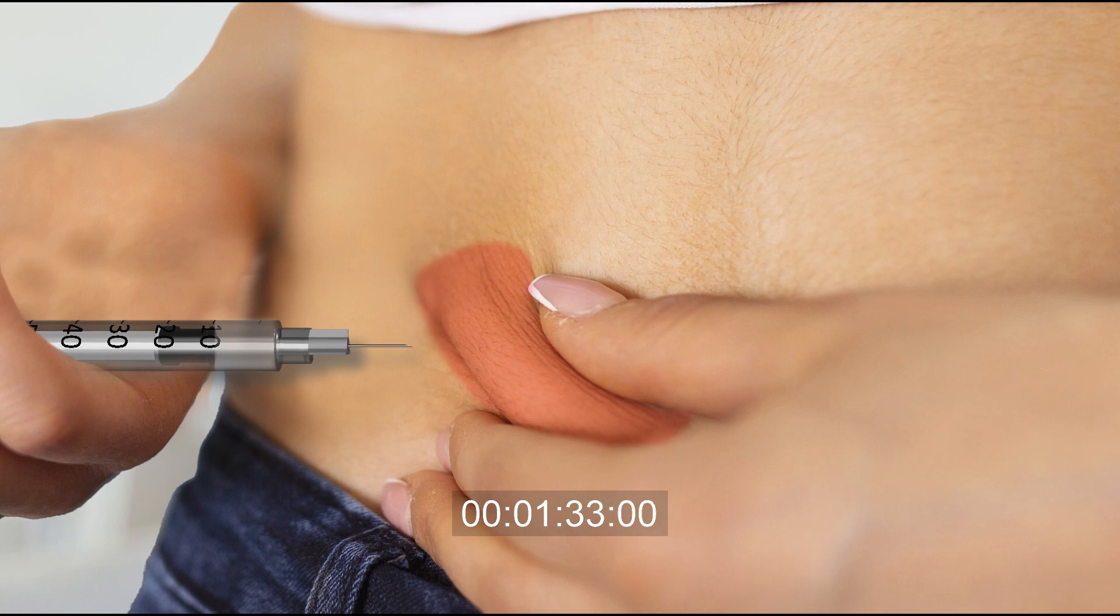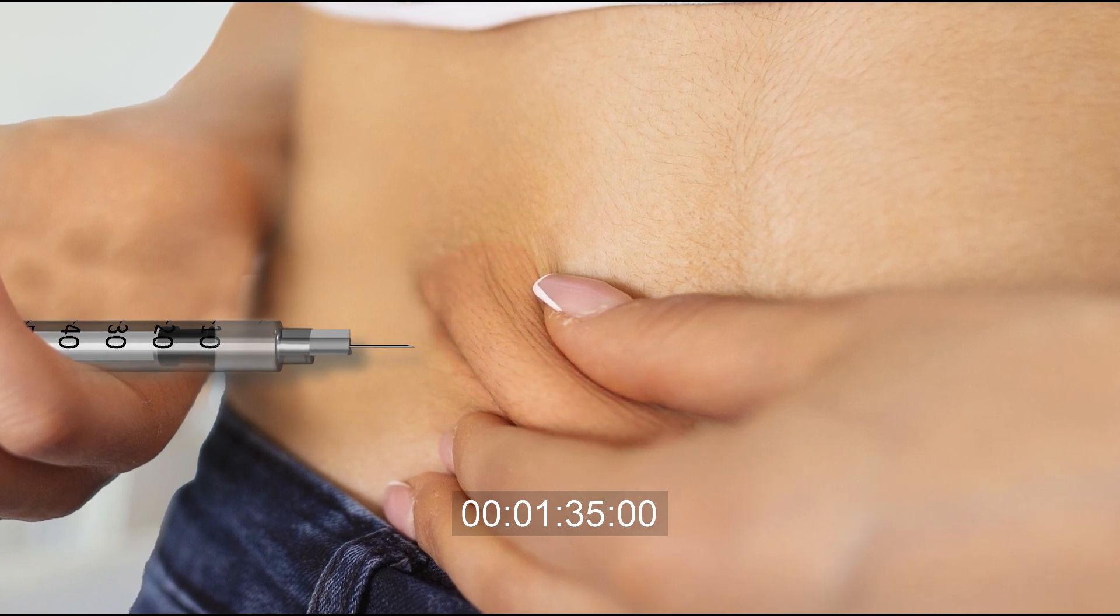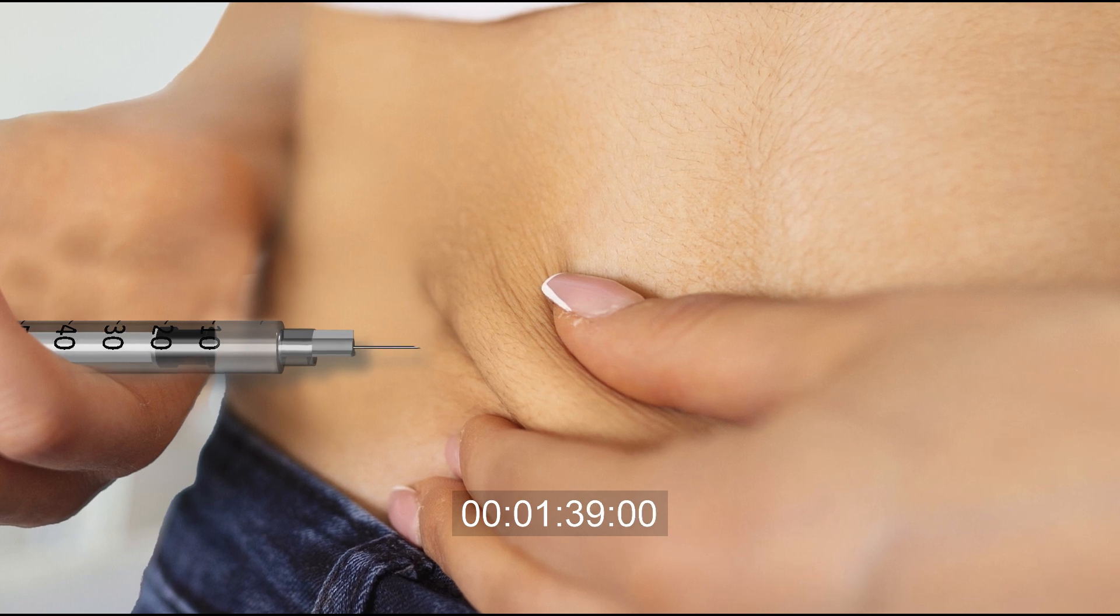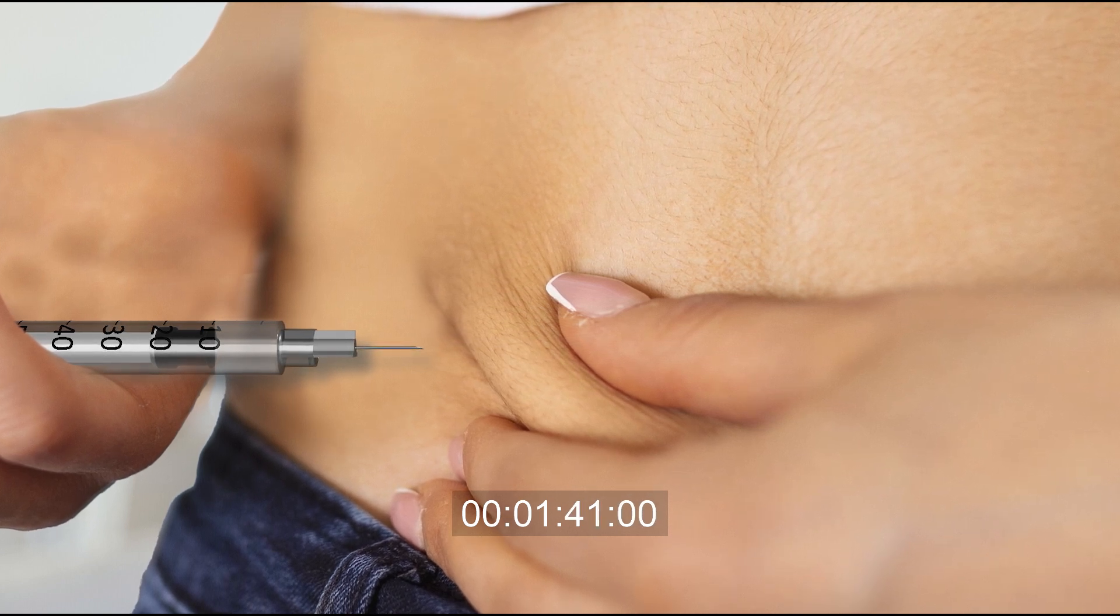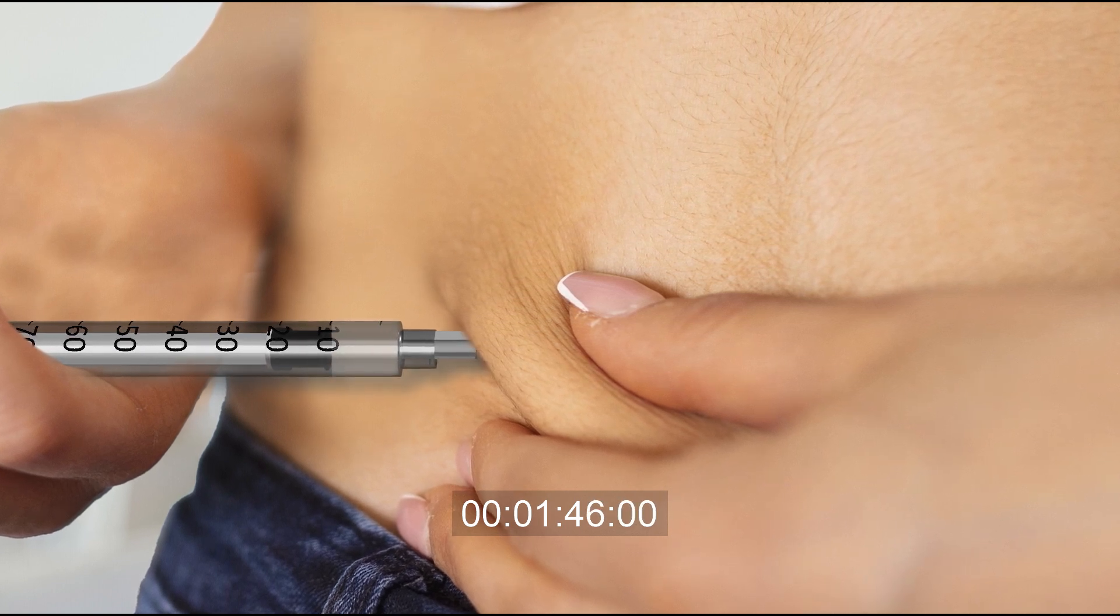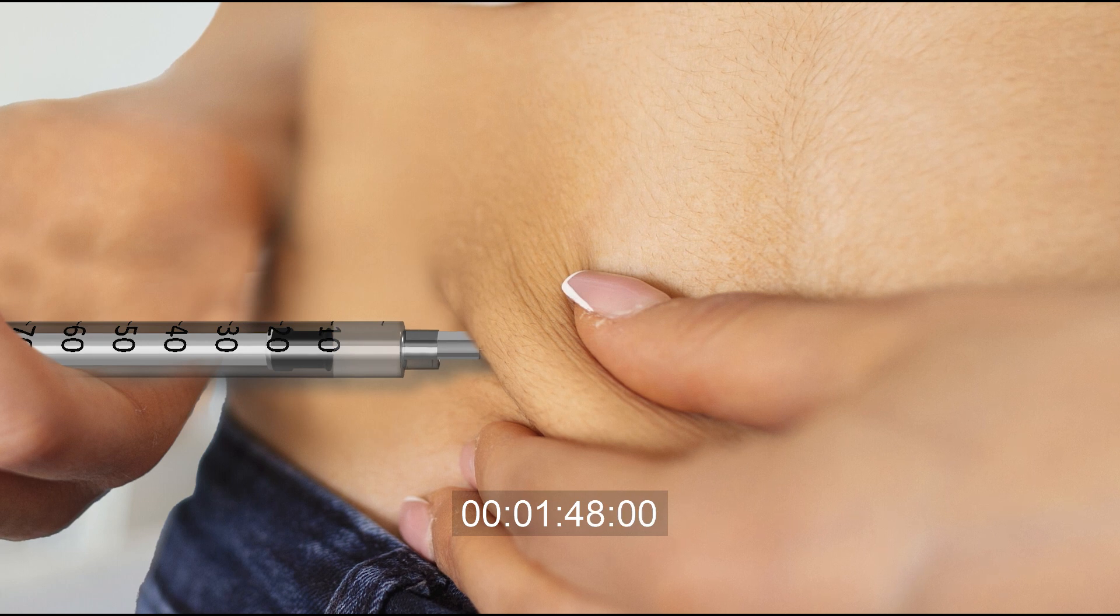Pinch a fold of your skin between your thumb and finger. With your other hand, hold the syringe like a pencil. At a 90 degree angle to your skin, insert the needle with one quick motion. Make sure that needle is all the way in.